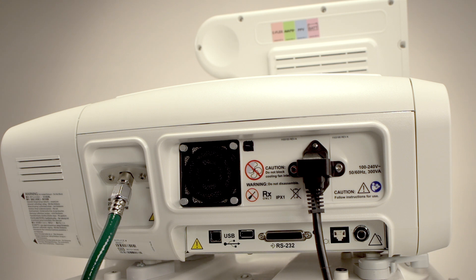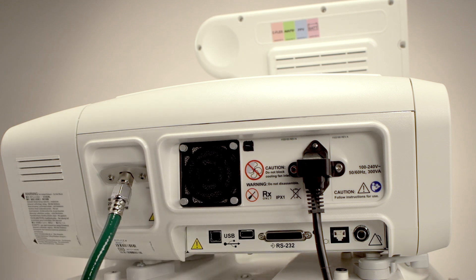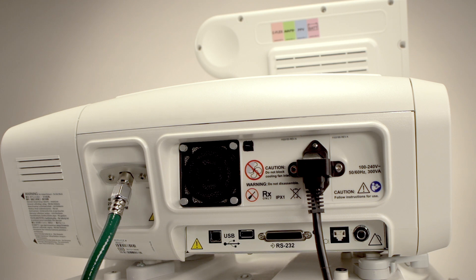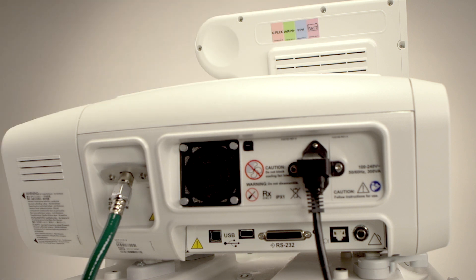Rotating the unit another quarter turn reveals the input and output connections and the cooling fan for the electronic components. 50 PSI oxygen is connected via a country-specific high-pressure hose fitting. There is no input for compressed air, as the V680 has an integrated blower for supplying the air portion of the patient gas mix. There are two USB ports for future options, and the RS-232 connection is for software updates, as well as interfacing the V680 with hospital information systems and monitors. It is also used to connect the unit to the RespiLink system, where available, for remote software upgrades and diagnostics. The Ethernet port and status display light are for future use. The final port on the right side of this panel is an analog connection for a nurse call system. Please note the colored labels on the reverse side of the GUI, which show which options are installed in this particular V680 for easy reference.